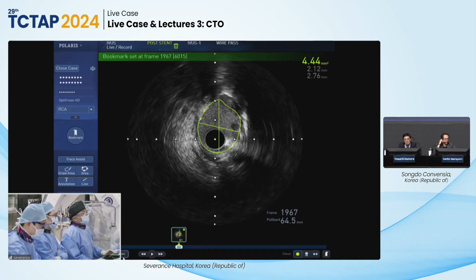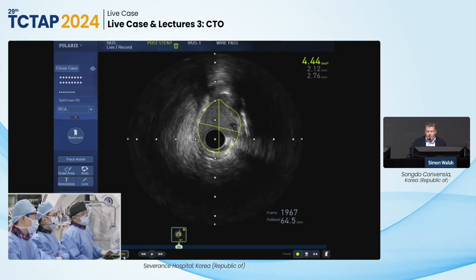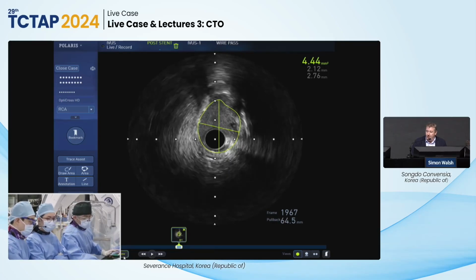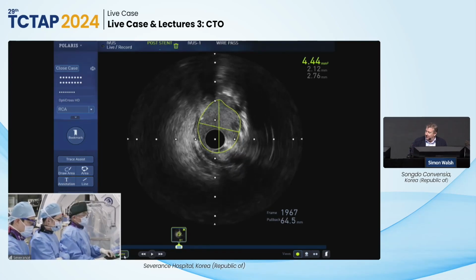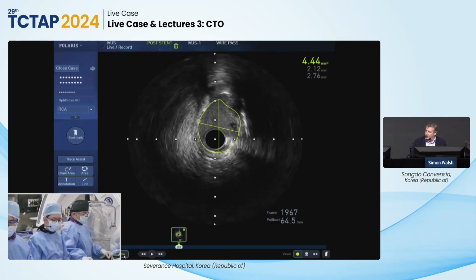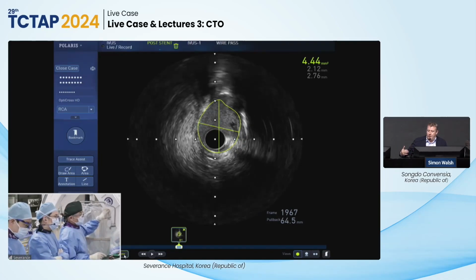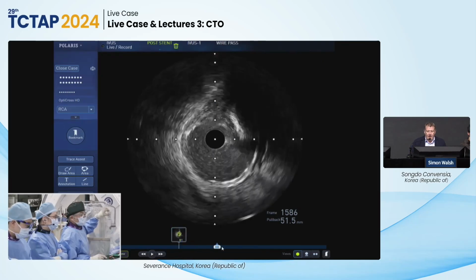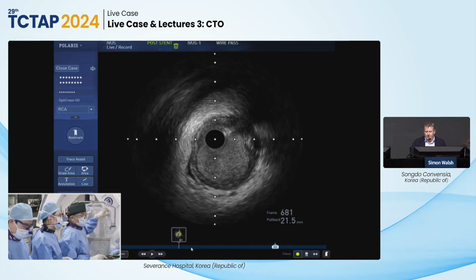Yeah, I think this reinforces that we really do gain useful information by one-to-one size pre-dilation ahead of stent implantation. Even though there was nothing immediately obvious in that IVUS, it told us that region was going to be the thing that had the relative under-expansion of the stent. If we'd taken a 3.0 long NC balloon and seen that we didn't have full inflation, it offers you the opportunity to make a different decision, cutting balloon, whatever is appropriate for the lesion you're faced with. And I think that information is very useful.